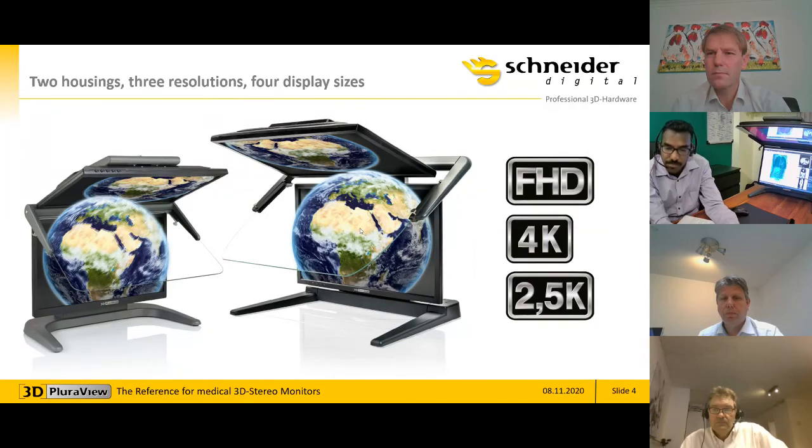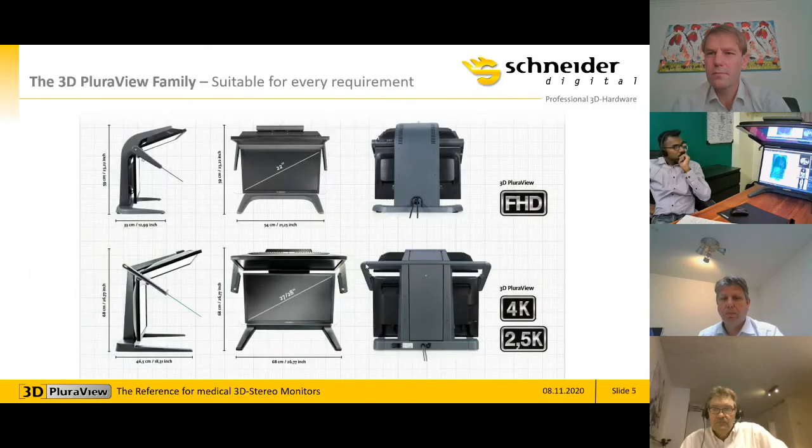The PluraViews are available in full HD, 2.1 megapixels, and 2.5K. That translates to 3.7 megapixel displays, and the 4K is a staggering 8.1 megapixel display. So each panel has 8.1 megapixels as a 4K model. And of course, with dual screens, you get the full resolution for each of the stereo channels.